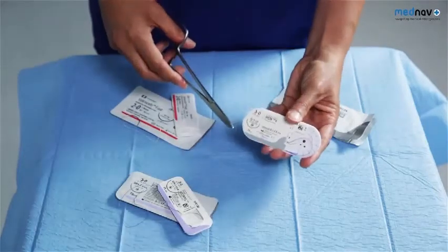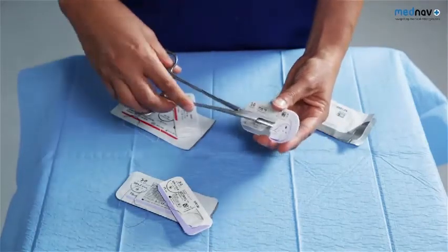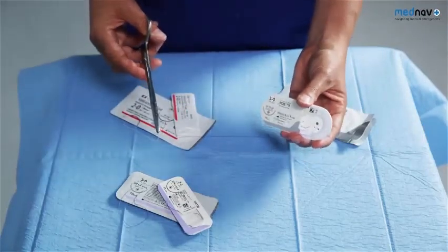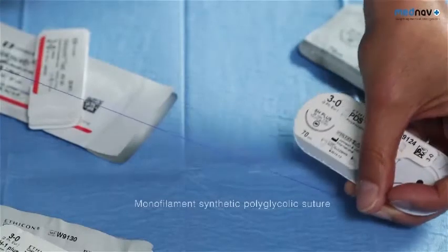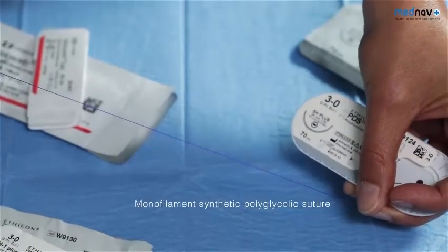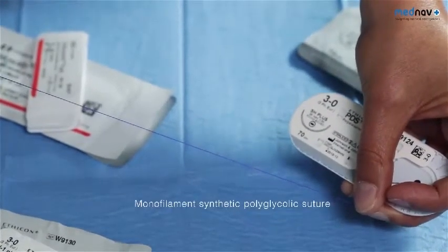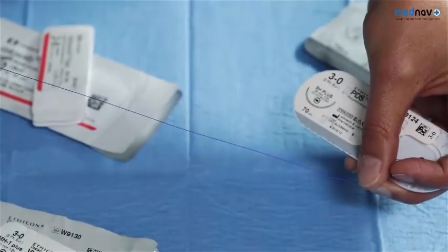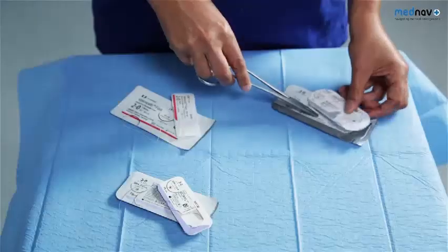To repair the external and internal anal sphincter, you'll require a monofilament, fine, slowly absorbable suture, such as a 3-O PDS. These absorbable sutures have been shown to be preferable to non-absorbable sutures, as they reduce the risk of perineal abscess formation and pain that means the suture has to be removed following delivery.